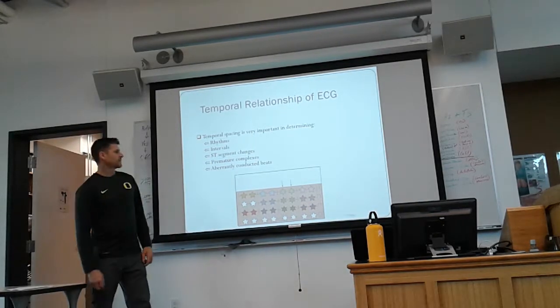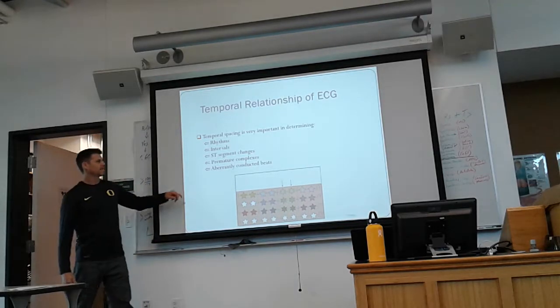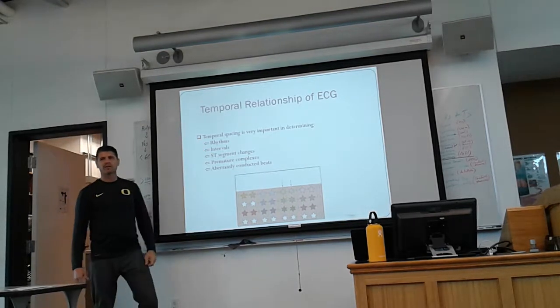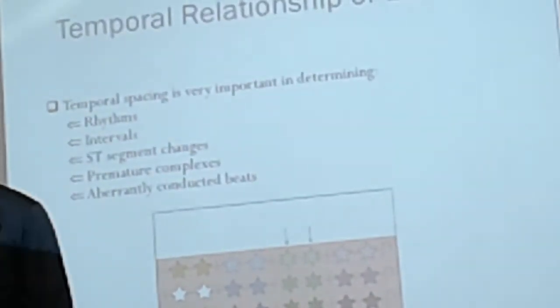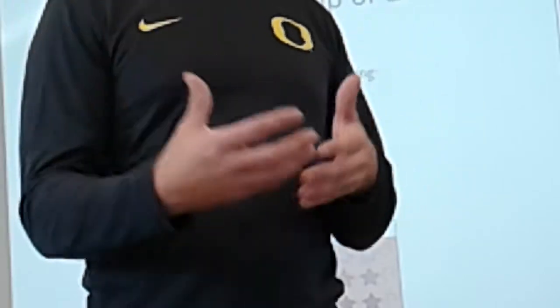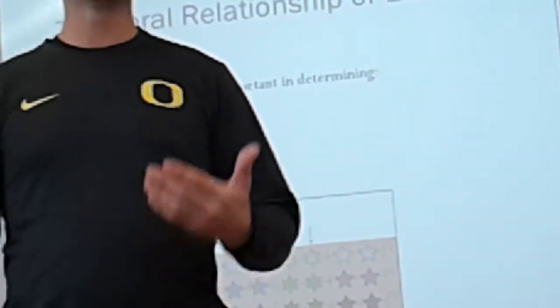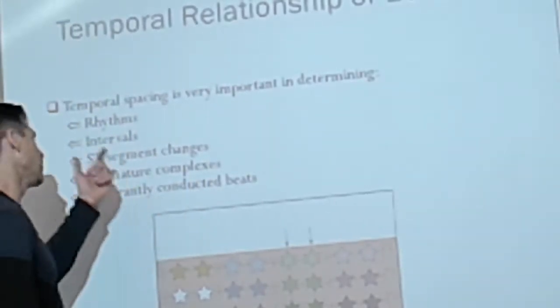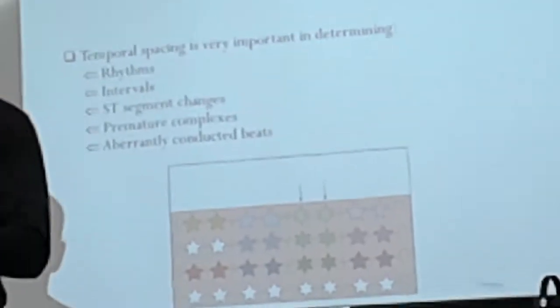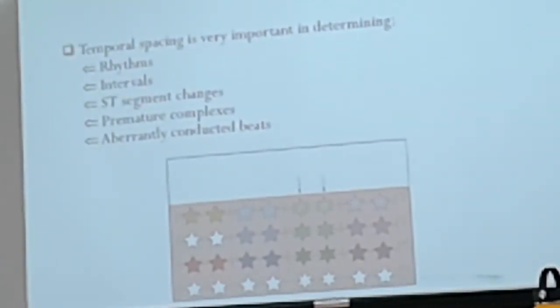So when we look at this, it tells us a lot, right? It lets us measure these intervals a little bit better. If I'm looking at lead one and I've been asked to get a good measurement of the PR interval, for example, but the P wave looks weird, or maybe the start of the QRS complex looks weird, or that lead is not showing me a good P wave, I can just move to a different lead at that same time and get my measurement. That means I can use any PR interval anywhere in that EKG to get my actual measurements. I can find the one that looks the best.